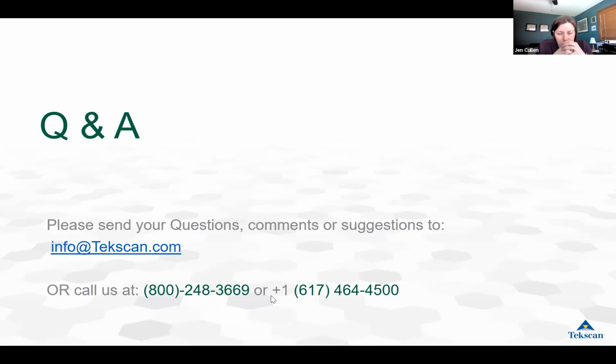A question came up around DSD integration. So the Novus product has an integration with DSD. So if you're a digital smile design dentist and you're using the DSD app, you can easily send your scan from the Novus product to your DSD app for patient analysis, and there's a number of features. So we'll actually send you a link to that video, or you can go on our website to our partner page to see a link there.